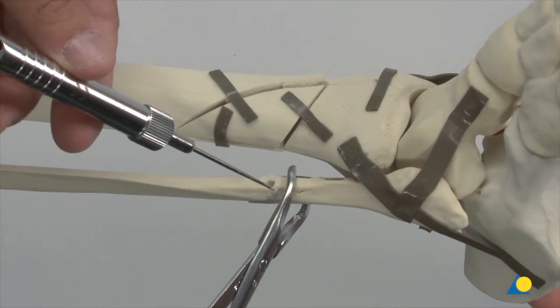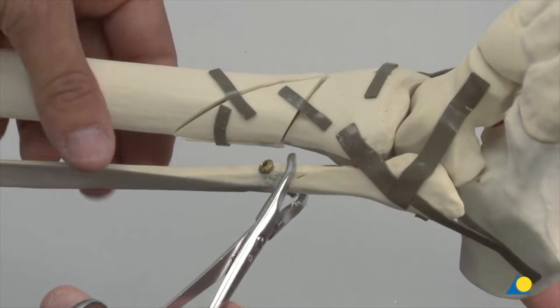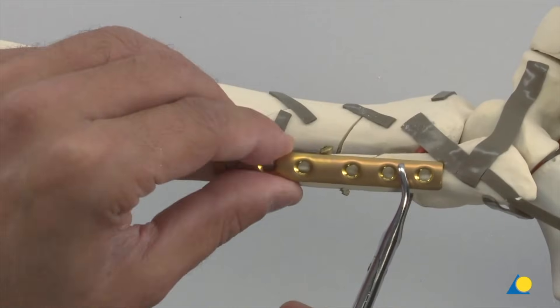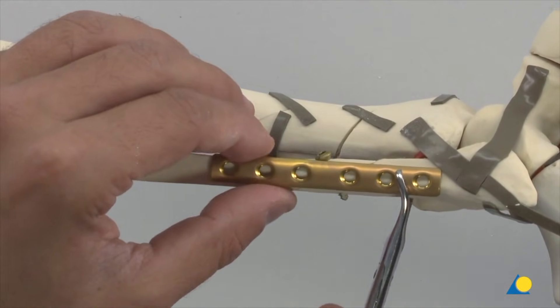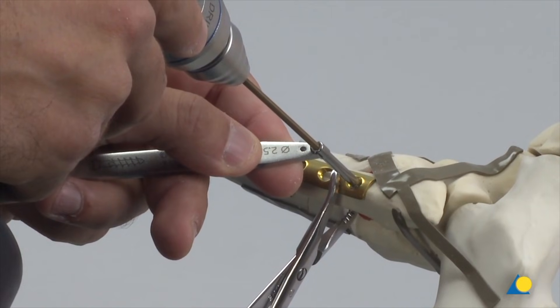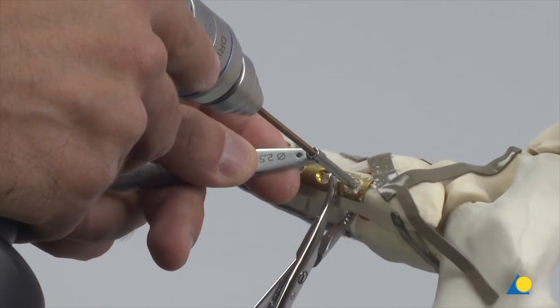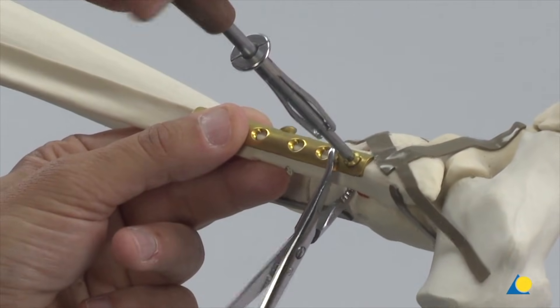The hole is measured with the depth gauge. A 3.5 mm self-tapping cortex screw is inserted. The reduction forceps is now removed. Next, the LCP one-third tubular plate is positioned on the fibula and held in position with forceps. The 2.5 mm end of the double drill guide is used to drill a hole distally, which is measured with the depth gauge. A 3.5 mm self-tapping cortex screw is inserted.